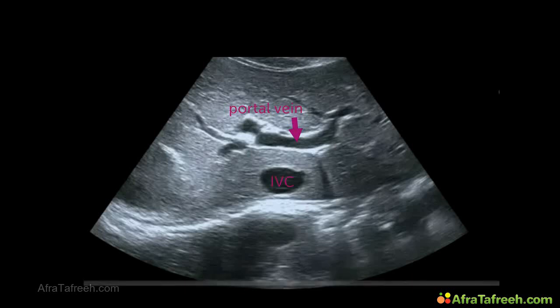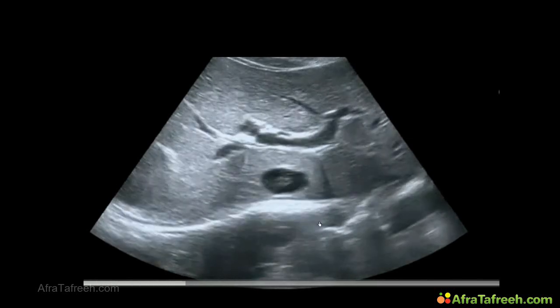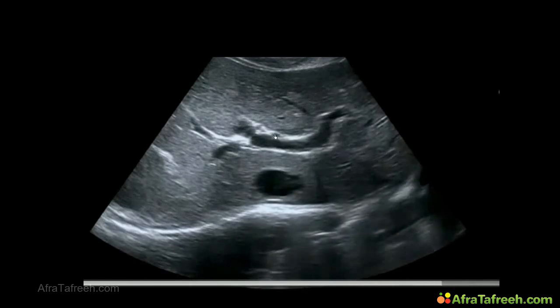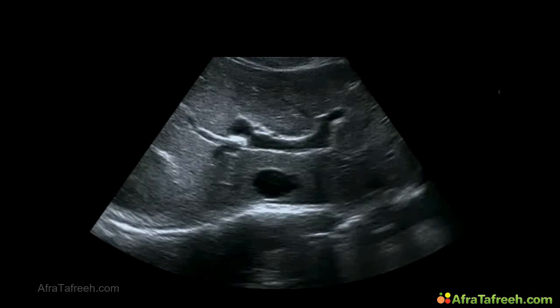Or this picture. This is a video clip. IVC, portal vein, with clear white borders around it. Common hepatic bile ducts on the back of this structure, anterior. Okay. Next picture. It's a video again.